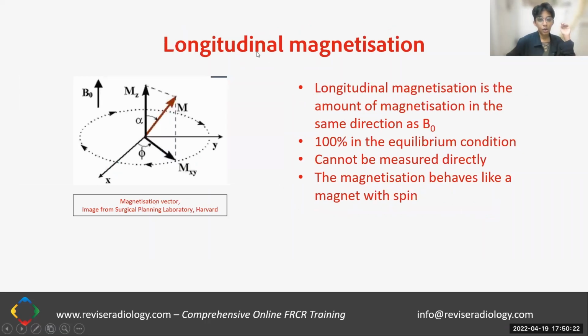Okay, so we've got an understanding of what nuclear magnetic resonance is, and from this we need to understand how we give rise to the T1, T2, and the T2 star.